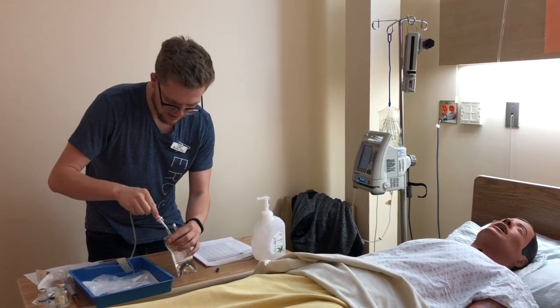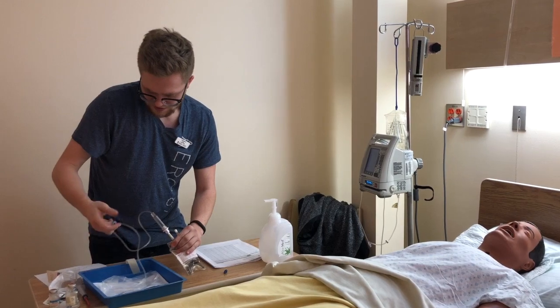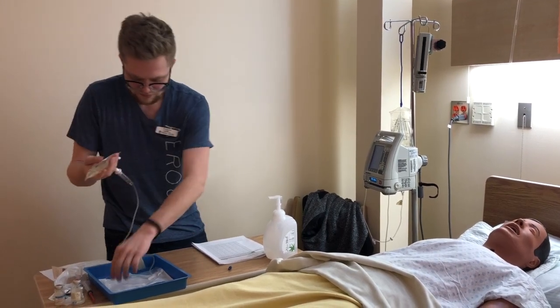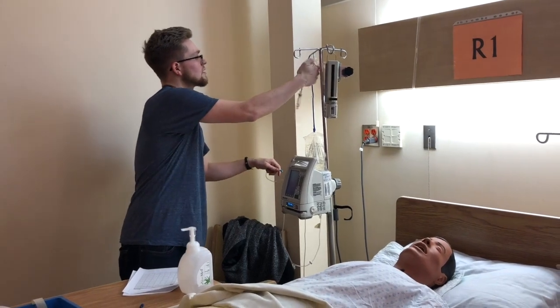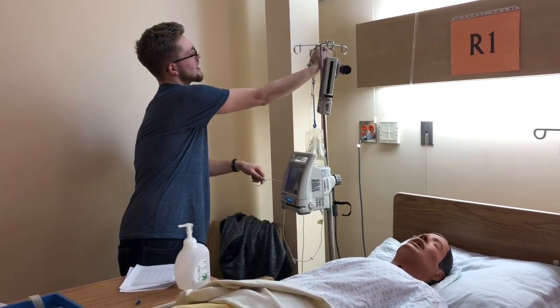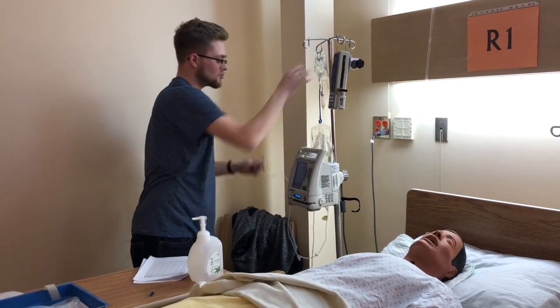And then we're going to spike our bag, like so, okay. And make sure that clamp is on so it doesn't go flying everywhere, good. So now I'm going to hook this up over here. And also at this time, I want to mention, I didn't do it quite yet, but you want to make sure that you do that third med check.